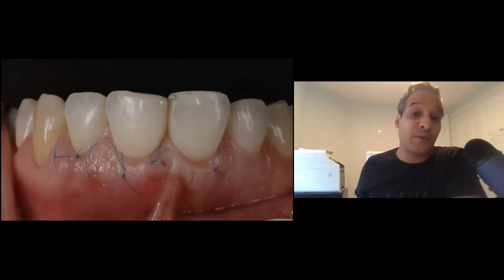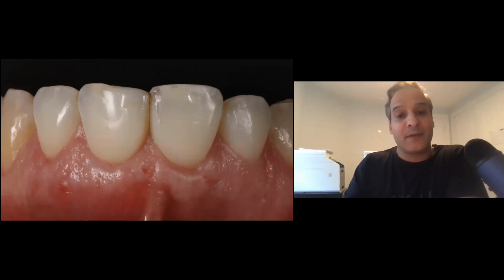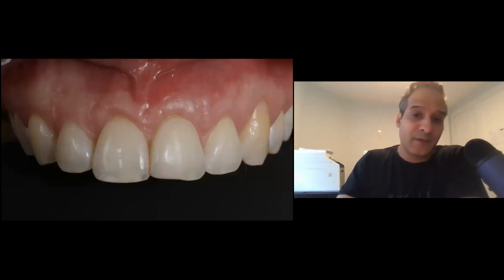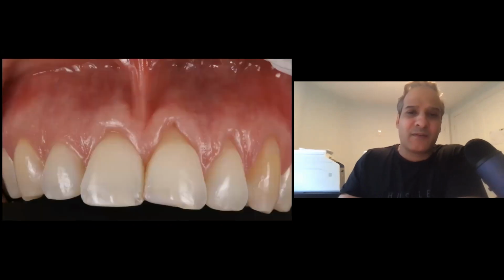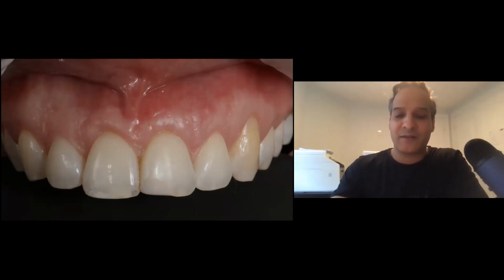And this is at 2 weeks post-op. You can see even with a smaller gauge suture, a 7/0, the tissue heals even nicer, so there's less interruption of the blood supply. And this is how it matured, after a few weeks or a few months, I think. We started off like this and we ended up like this. Sometimes when you look at this, it's hard to tell. There's no scarring, there are no incisions. It looks much more natural than some of the other procedures.